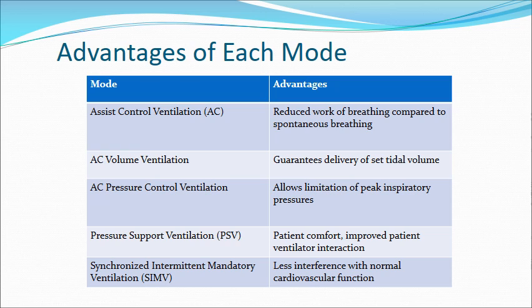AC volume ventilation guarantees delivery of a set tidal volume, which can keep the minute volume at target, and that's a major concern for respiratory therapists. Pressure control ventilation, however, limits the peak inspiratory pressures, which is also a very good thing.